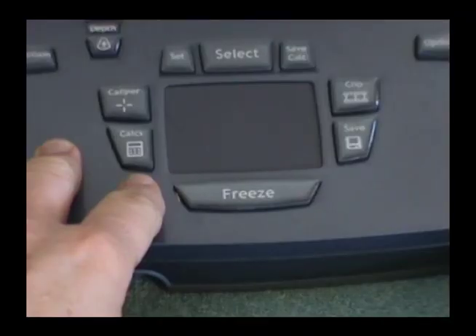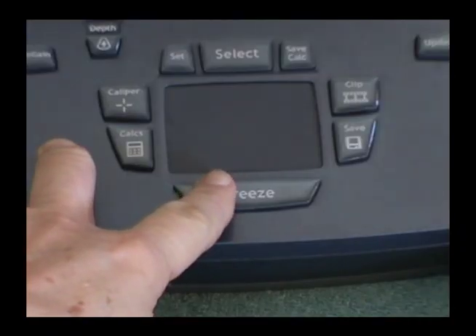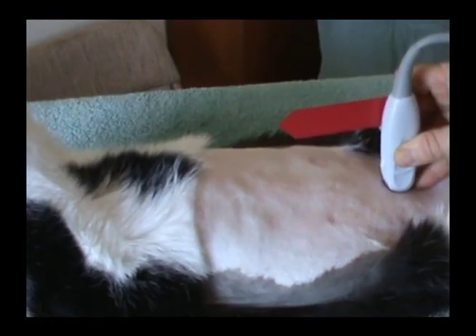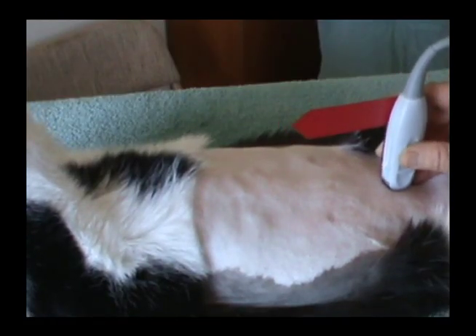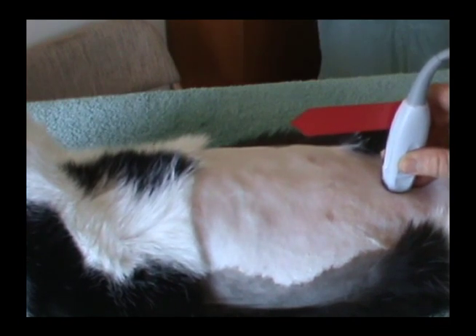Remember to keep one finger of the keyboard hand on the freeze button ready to capture the best image. When you press the freeze button, practice leaving your transducer hand relaxed and in position so that when you unfreeze, you will still have the same image. This will save you time and effort.